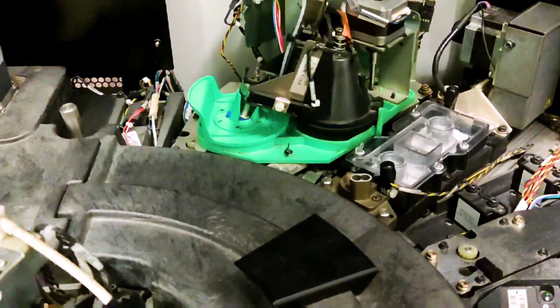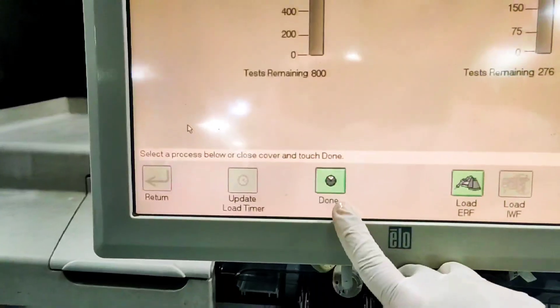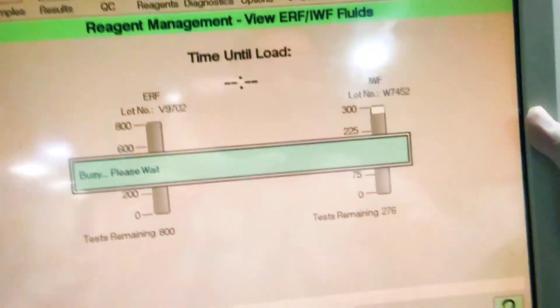The machine will analyse the fluid by itself and update the number of test counts as displayed on screen. Lastly, we will close the cover and click on the Done icon at the bottom to re-initialise the system.